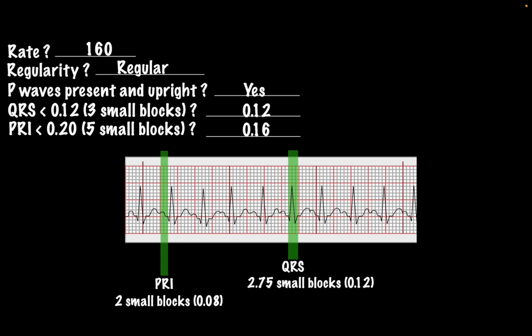So to diagnose these patients with SVT, we got to take a good look at their history. If somebody's at the gym and has a heart rate of 160, that's acceptable. If somebody's blood pressure is starting to decrease, and this is again a chronotropic response, that's acceptable. But if they were sitting there watching Jeopardy, well, that 160 starts to seem a little fast. Another little tool you can use is your maximum tachycardia. Now, this isn't an exact number, but it's a roundabout. And you take 220 minus the age, and anything above that number, if you don't have a cause for it, is probably due to SVT.